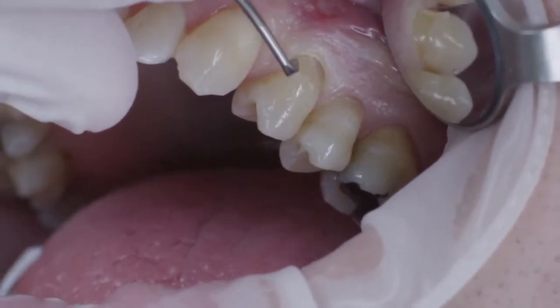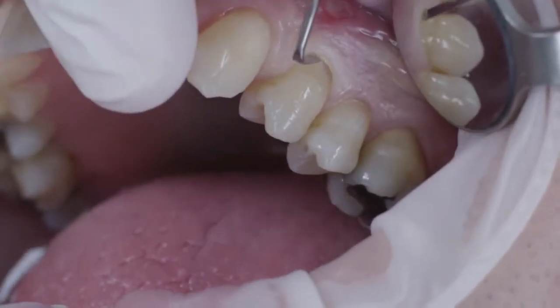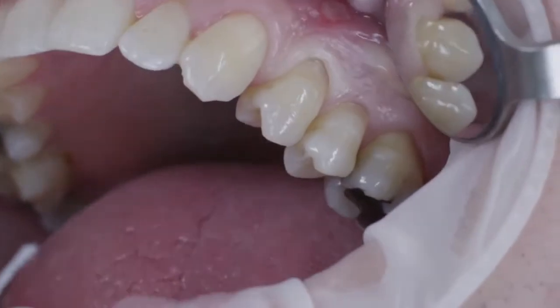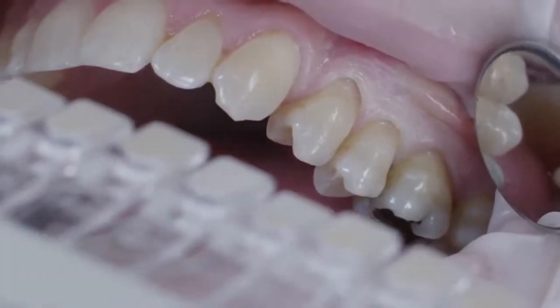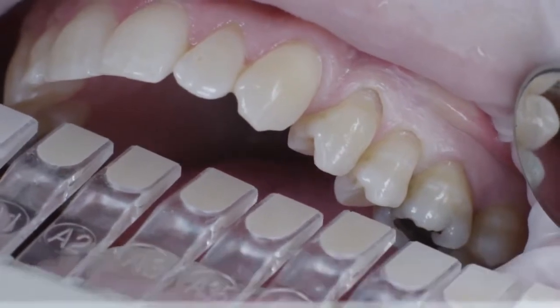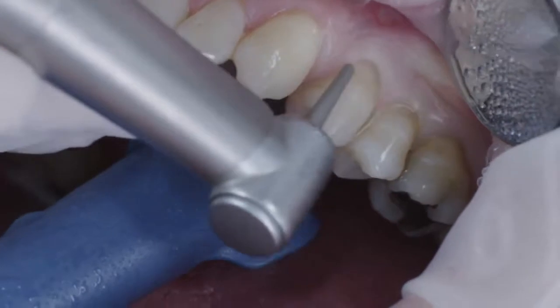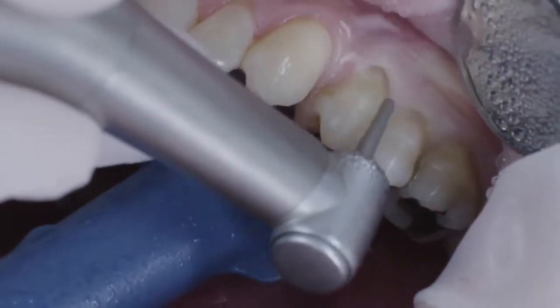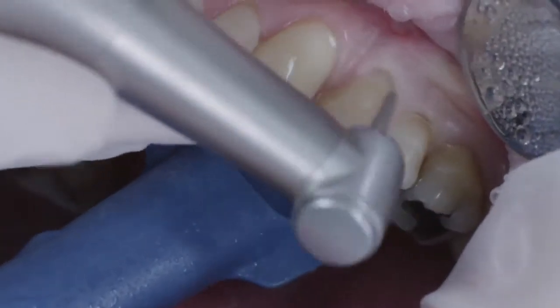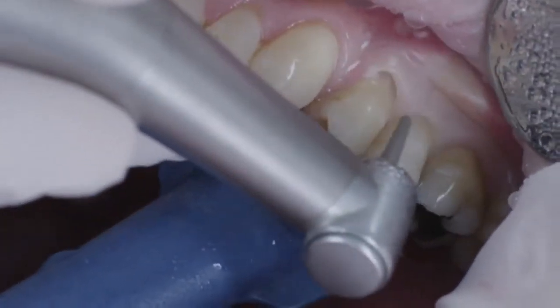To expose the preparation margins, a cord size 0 was placed in the sulcus. I used the Venus Pearl shade guide for shade selection and chose A3 as the basic shade in this case. In order to improve the adhesion as well as the optical characteristics in the transition area of the composite and the tooth substance, I used a fine-grained diamond tool to prepare the enamel.